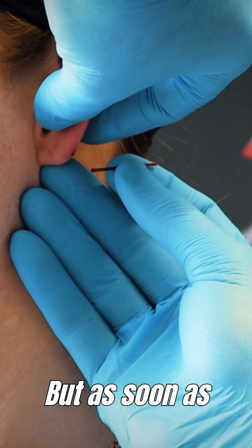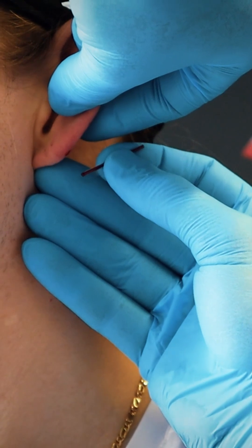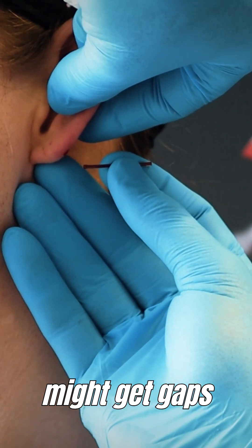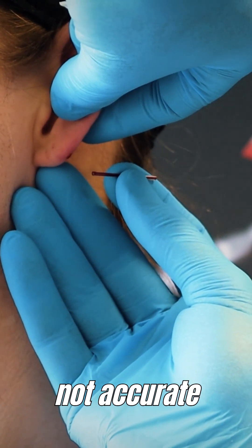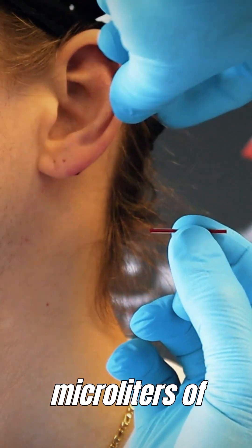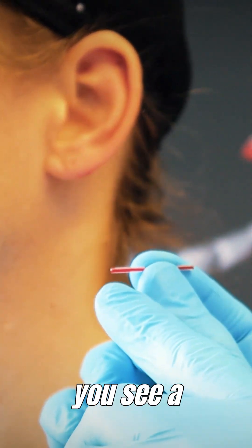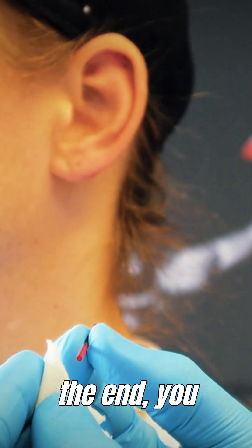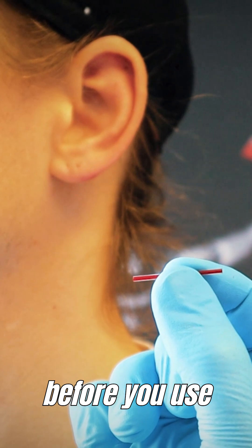As soon as you stop, you want to tilt it in this direction, because otherwise you might get gaps — air bubbles — in it, and then it's not accurate. The assumption is that you get exactly 20 microliters of blood volume into these capillaries. And that's also why if you see a little bit of extra blood on the end, you want to clean that off before you use it.